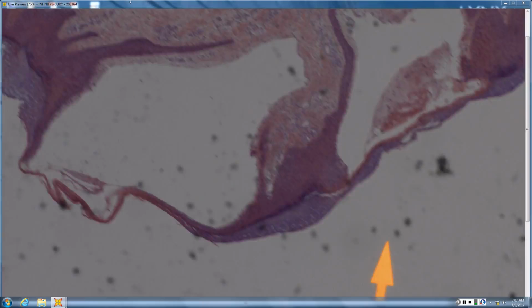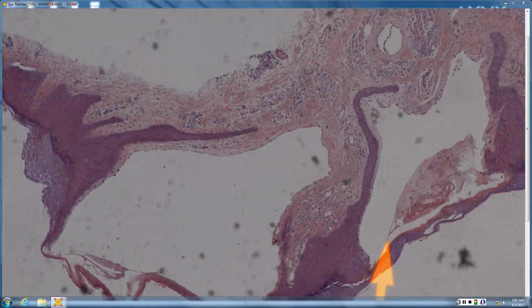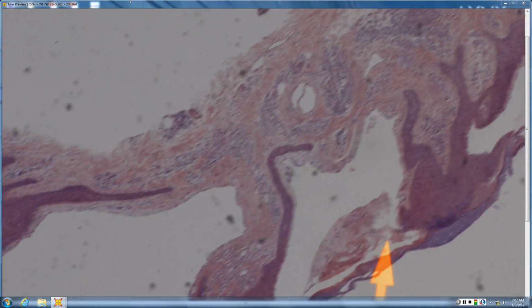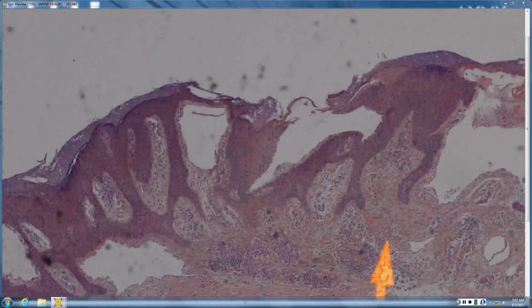And of course, you can get post-radiation angiosarcomas, which are c-MYC amplified, whereas c-MYC is not amplified in the atypical vascular lesions or the run-of-the-mill angiosarcs. So this is a lymphangioma. I'll try to turn it right side up for at least some of you.